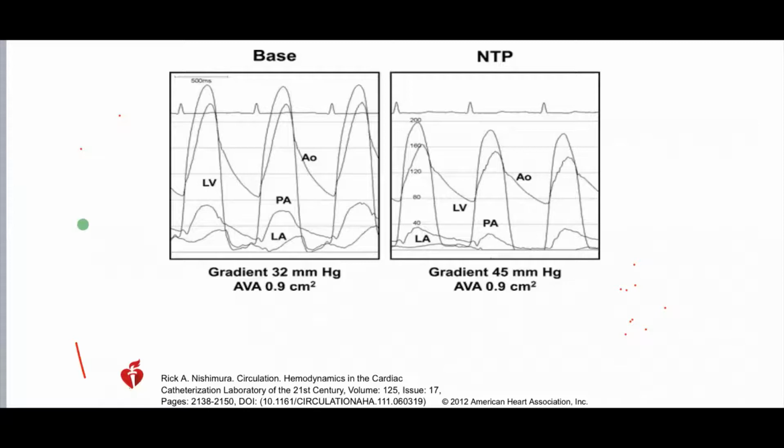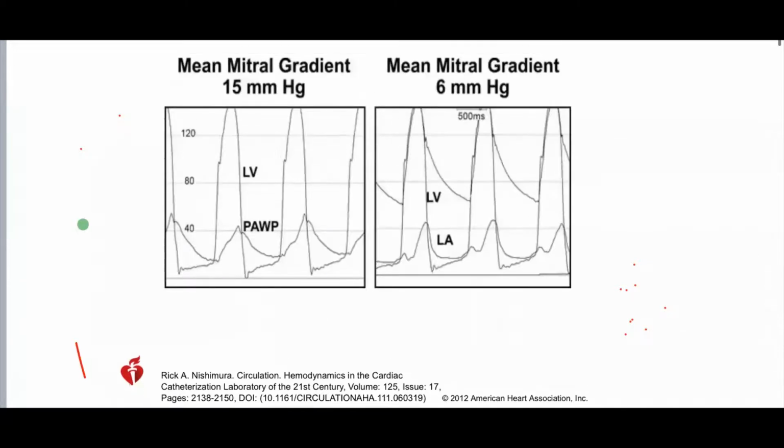Okay, good. Now, what is this? I promised to show you the difference between the wedge and the LA pressure tracing. And here is the difference. Look at this slide and tell me what you see.